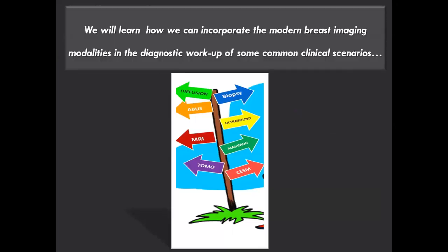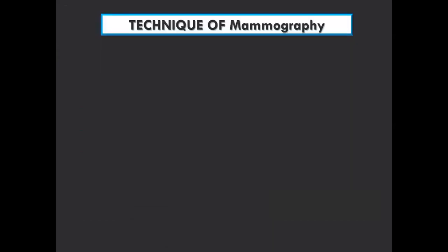And so today we will learn together how we can incorporate these modern breast imaging modalities in the diagnostic workup of some common clinical scenarios. But before doing so, we should understand the basic principles behind these modalities.